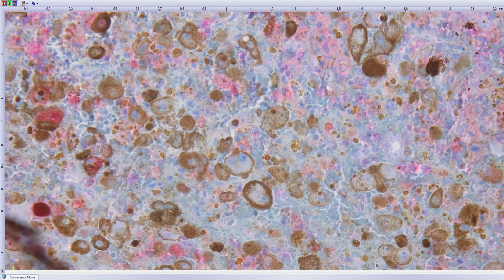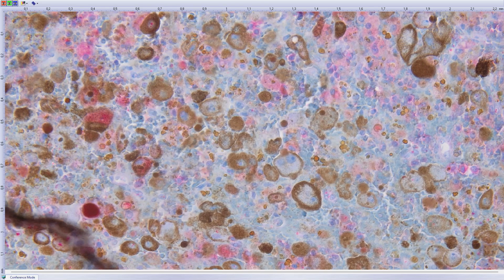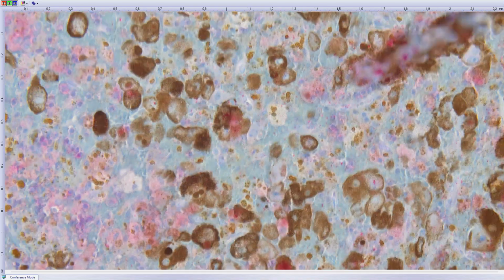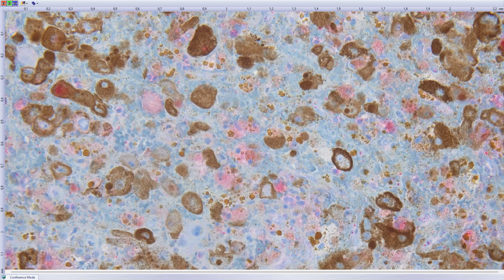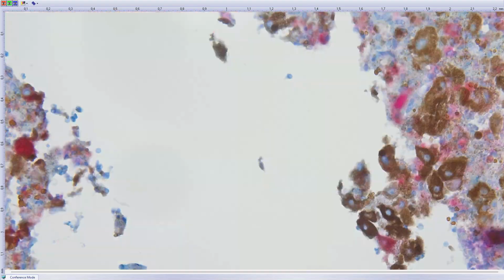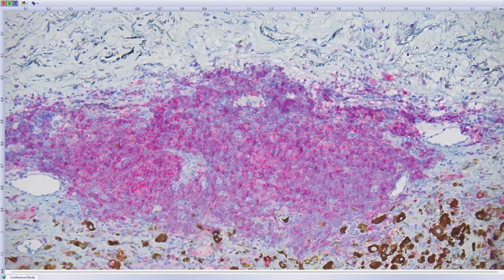So here in the center, for example, with the heavily pigmented cytoplasm, you can see clearly loss of expression in the cytoplasm, and the same in the vast majority, perhaps all tumor cells. The cells with expression will most likely not be tumor cells. If you find some lymphoid tissue, there is clear expression.